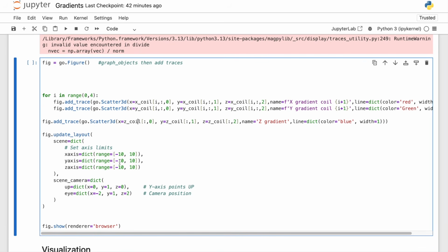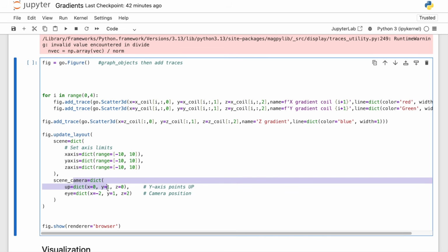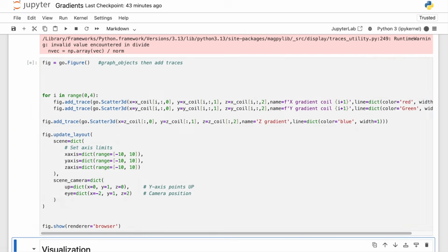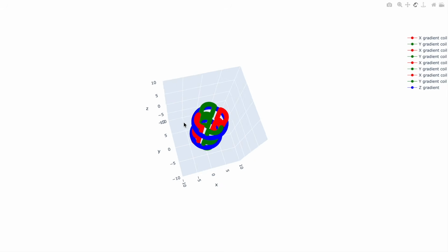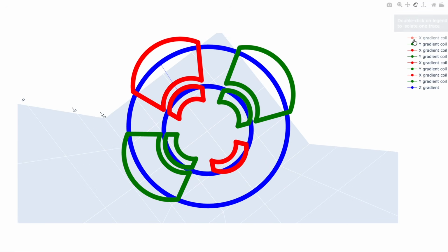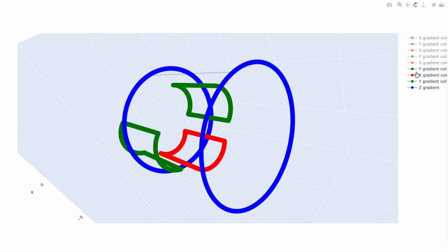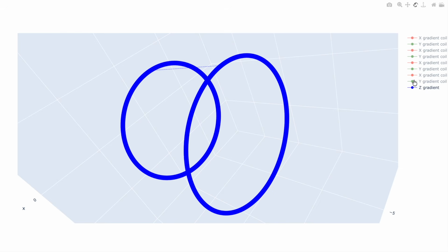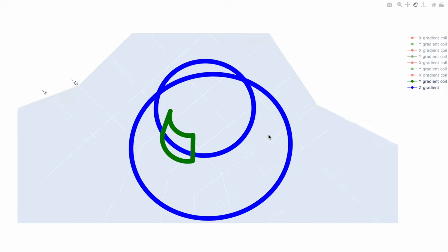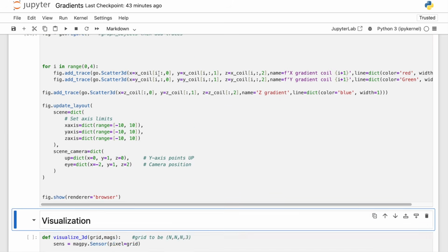And then I define my range here. The colors are defined here. The rest is subjective, which can be easily changed. And this is the camera direction or position. So let's run this as well. So here we see the coils in a more interactive way. Also here you can enable or disable some parts of it. So let's say we can just leave z gradient and see that, or y gradients coil 4. So as you can see, Plotly is better for more robust visualization.